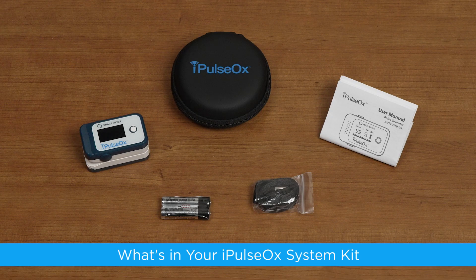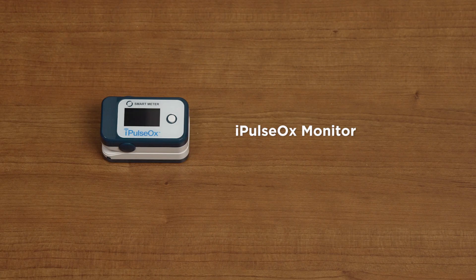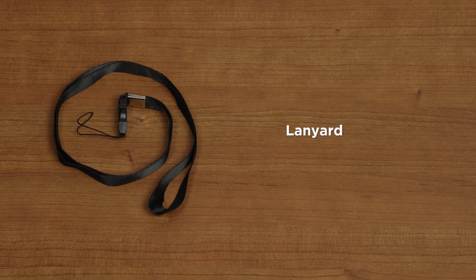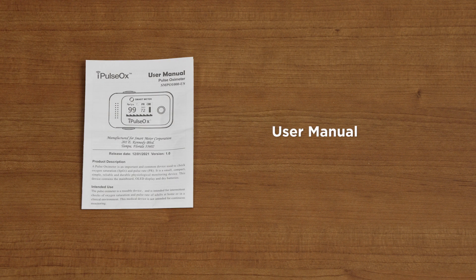What's in your I-Pulse Ox System Kit? The I-Pulse Ox comes with everything you need to take and transmit SpO2 readings, including the I-Pulse Ox Monitor, carrying case, lanyard, two AAA batteries, and the user manual.